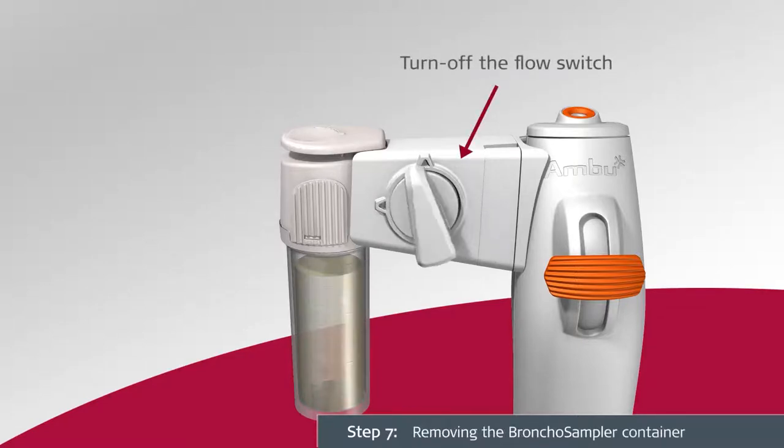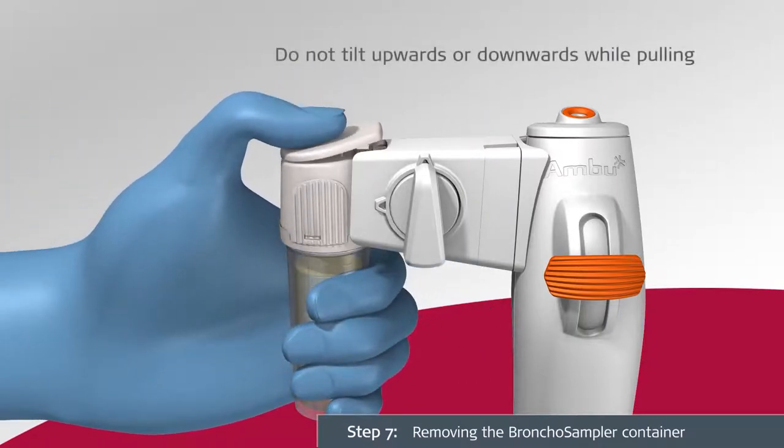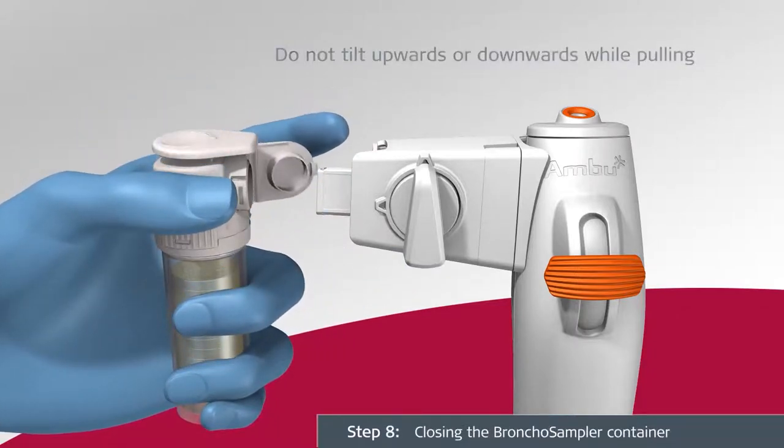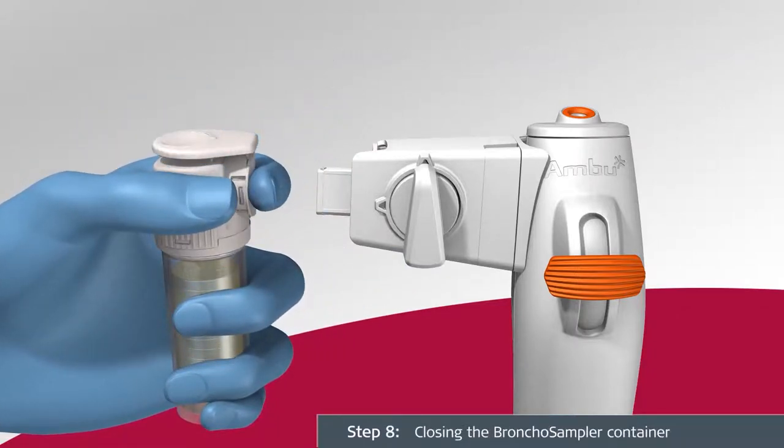To remove the sample container, press the flip top down and pull the sample container away from the sampler bridge in a fluid motion. Close the sample container by pressing the lid towards the sample container interface and engaging the click lock. Once the click lock is engaged, do not reopen the lid.